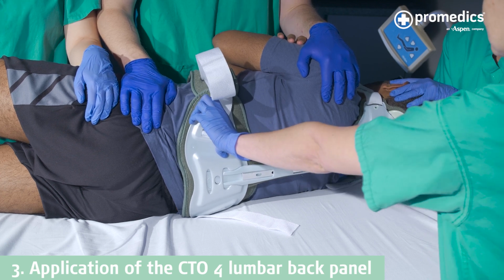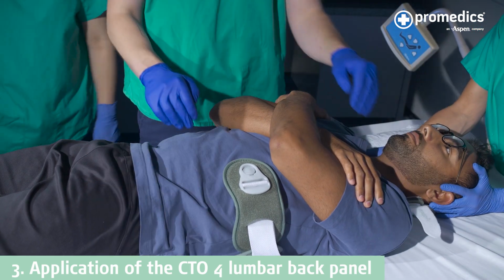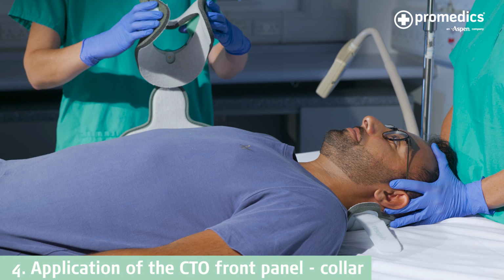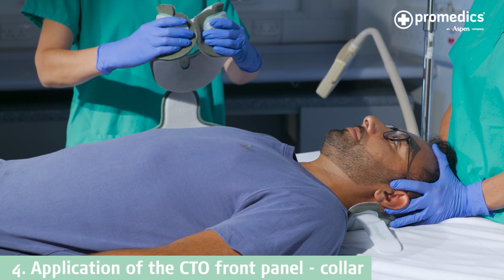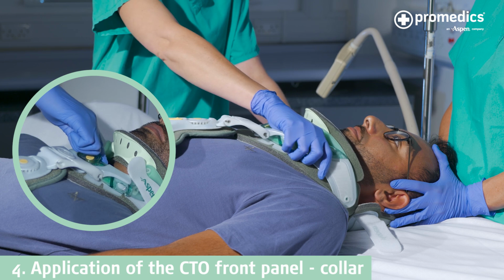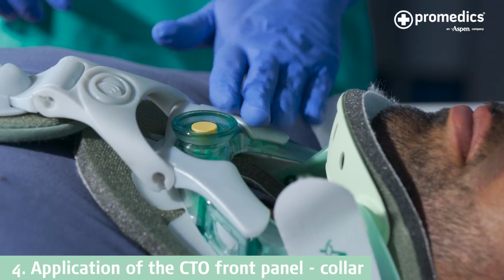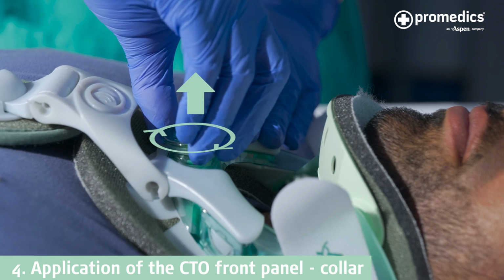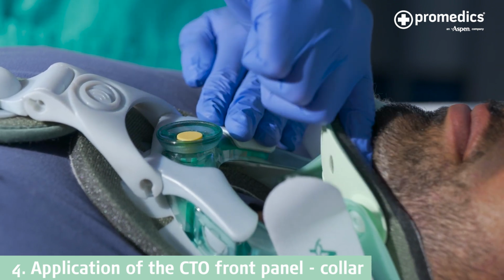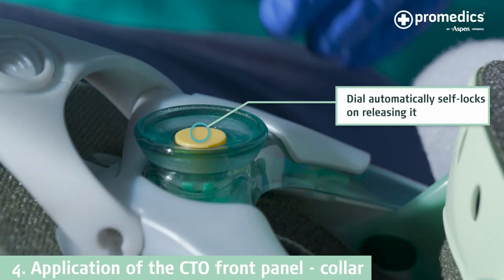Log roll the patient back onto the brace. Take the front section and pre-form the collar. Slide this under the patient's chin with the sternal notch visible within the access window. Dial the collar up by pulling out the dial and turning clockwise until the foam pad on the chin piece starts to compress. The dial will automatically self-lock upon releasing.